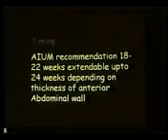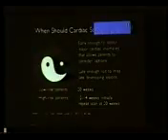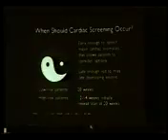And if it is more than 2 centimeters, say 3 centimeters thickness of anterior abdominal wall, it's quite possible to miss those entities which we are going to discuss. Low risk patients at 20 weeks and high risk patients between 12 and 14 weeks is the recommendation by the AIUM.